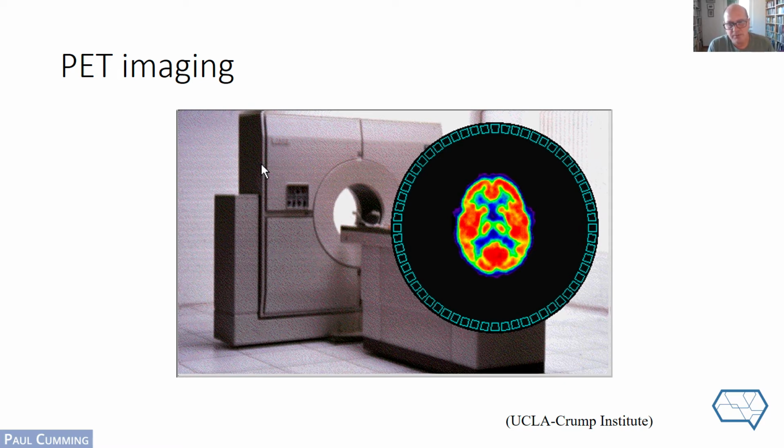Now, anyone who knows much about PET will look at that and say, it looks like an FDG PET scan, and in fact it is. Fluorodeoxyglucose is the most widely used tracer for molecular imaging in brain because it's so darn useful. Fluorodeoxyglucose contains fluorine 18 in its nuclear medicine application, and otherwise contains a derivative of glucose that behaves much like natural glucose, but carries with it the radioactivity from the fluorine 18. And so it allows you to track the metabolic activity in brain.